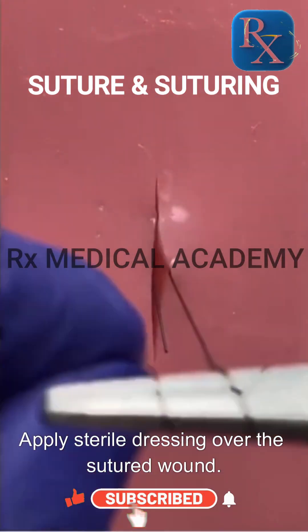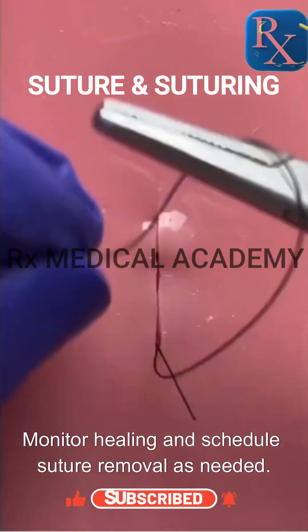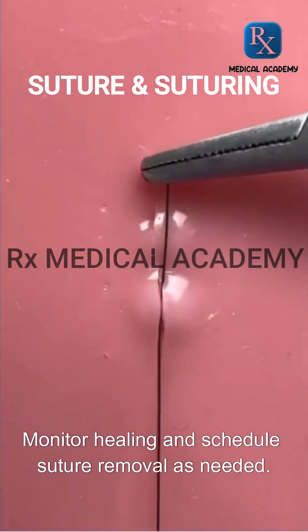Apply sterile dressing over the sutured wound. Monitor healing and schedule suture removal as needed.